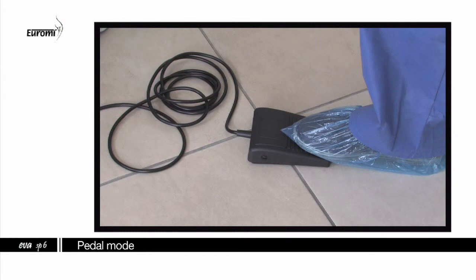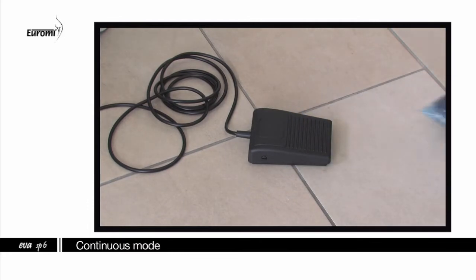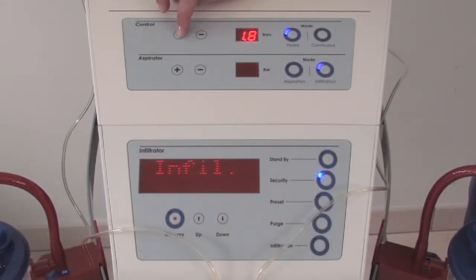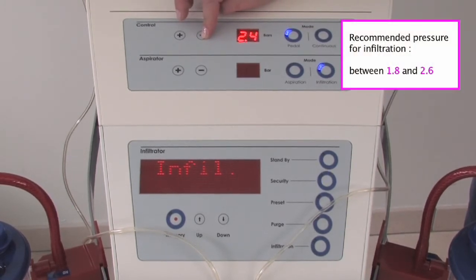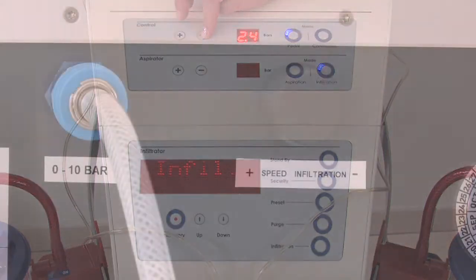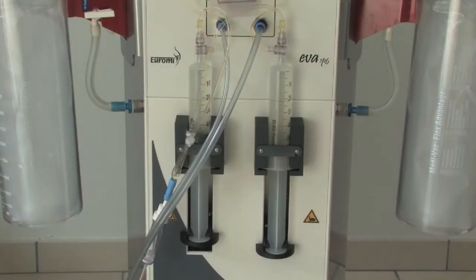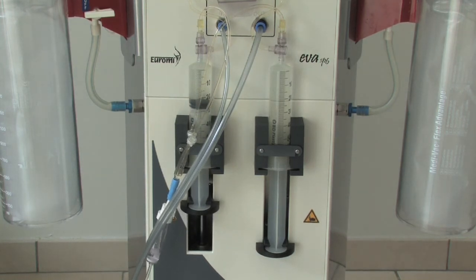Pedal mode allows the practitioner to start and to stop the system by pushing and releasing the pedal. In continuous mode, push once on the pedal to start the system continuously, push again to stop it. Adjust the air pressure. Pressure by default is 1.6 bar. The recommended pressure for infiltration is between 1.8 and 2.6 bar. Set the infiltration speed. Turn left to increase the speed. Minimal speed is 120 ml per minute and maximal speed is 360 ml per minute.